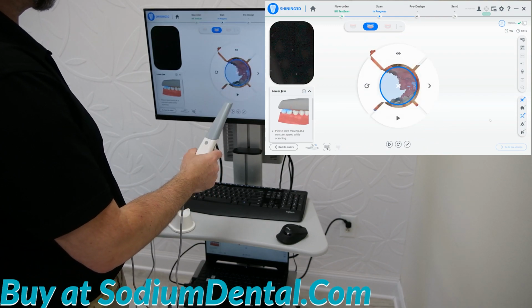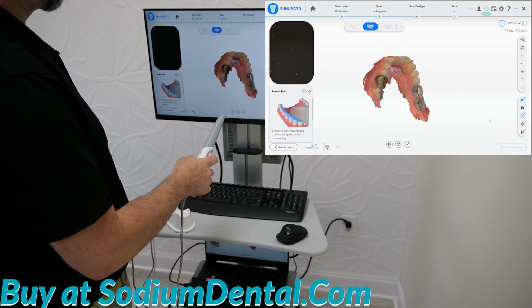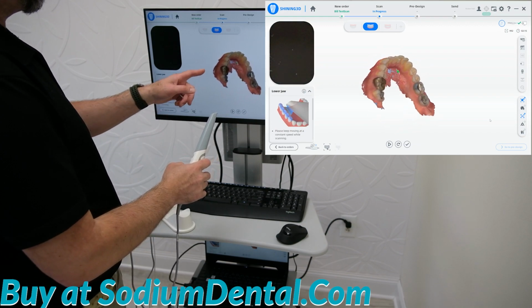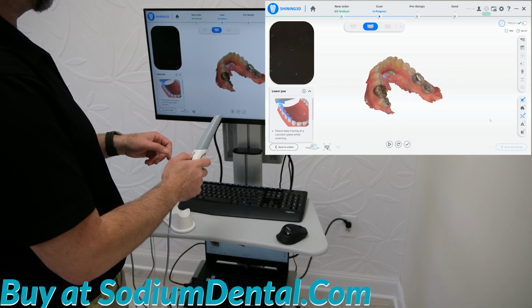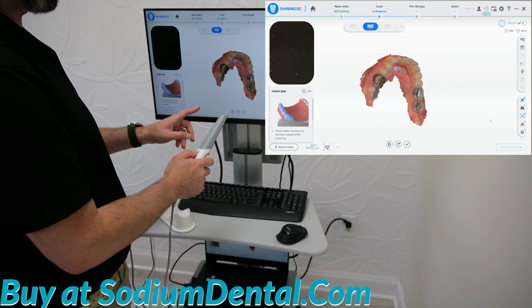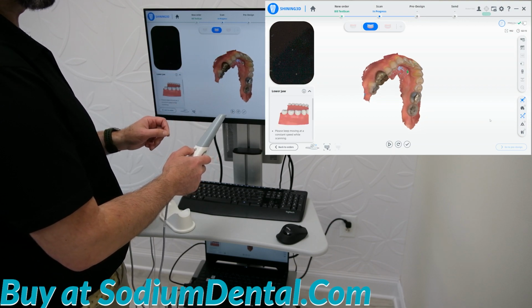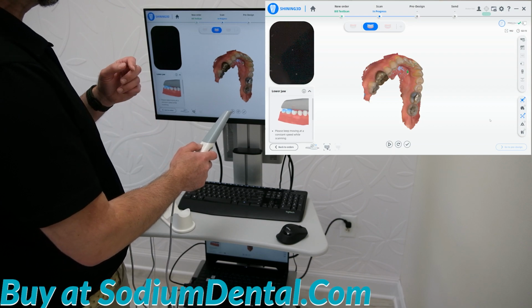We can double check the scan. And we see that we have a small part of an anterior where we could touch up the data. You will find that if you dry the teeth with air before scanning, you will almost never have to go back in and touch anything up.